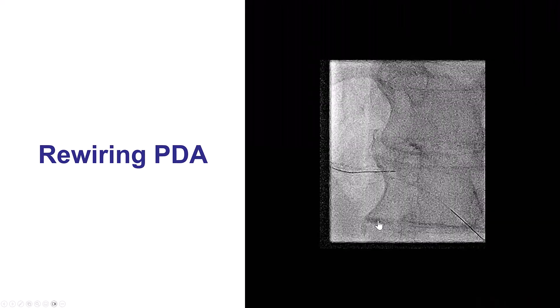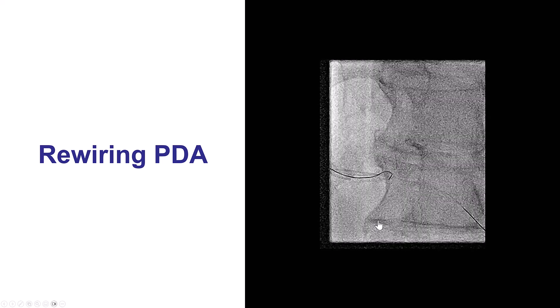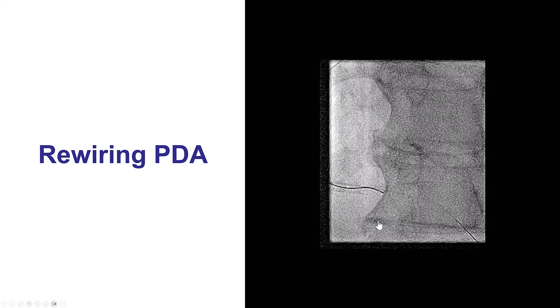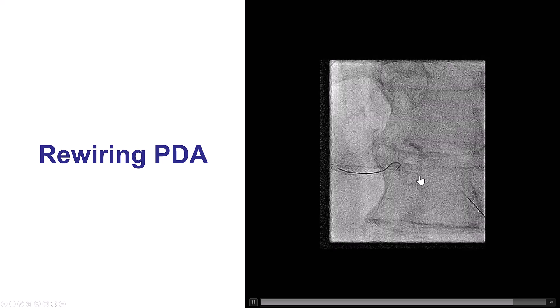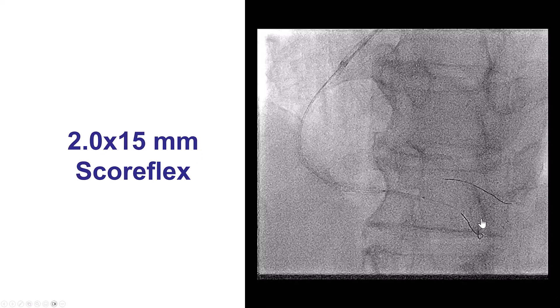So we rewired the PDA. Fortunately, rewiring was relatively easy — sometimes it can be tricky when there is significant stenosis. Trying with a standard workhorse guide wire, we were able to eventually engage the PDA and, with gentle manipulation and gentle rotation, advance the workhorse wire into the PDA.